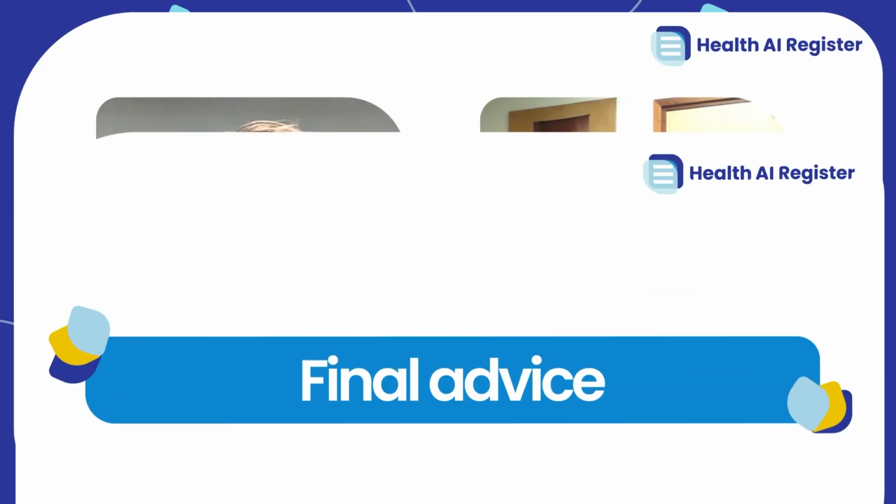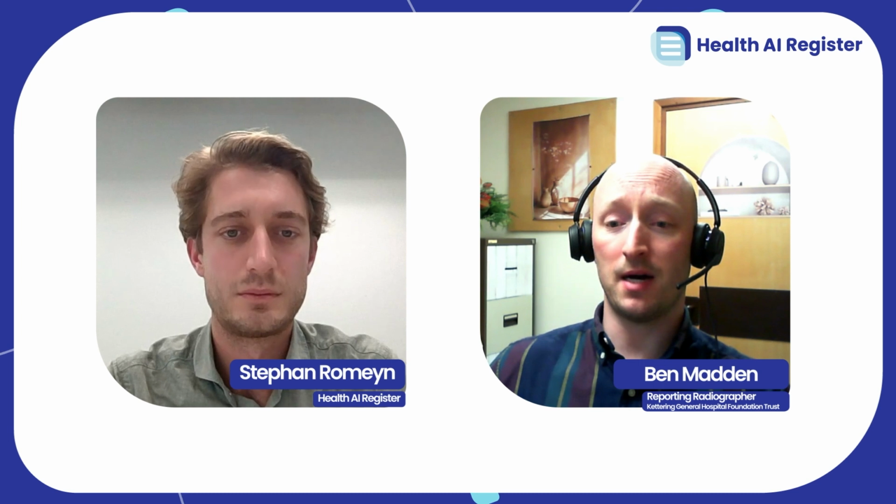And also to try to wrap up, is there anything else that you would like to share with the audience, maybe to help them ensure a responsible adoption of AI in their clinical practice? It was very challenging getting this over the line. I think if you're thinking about AI and implementing it in your department, it's very important to reach out to your digital team for the policies behind that.